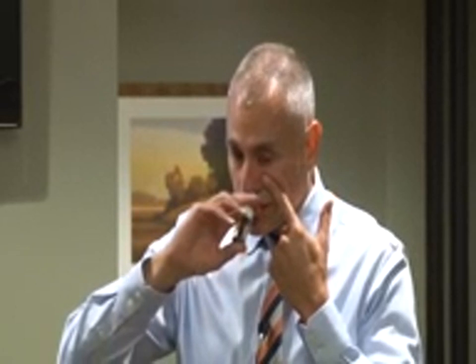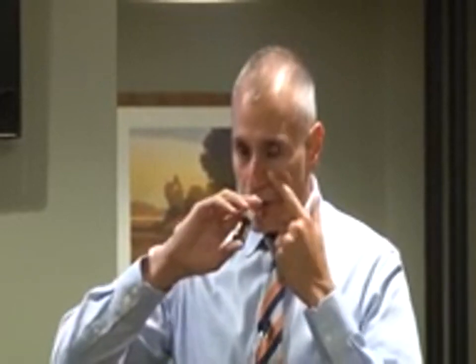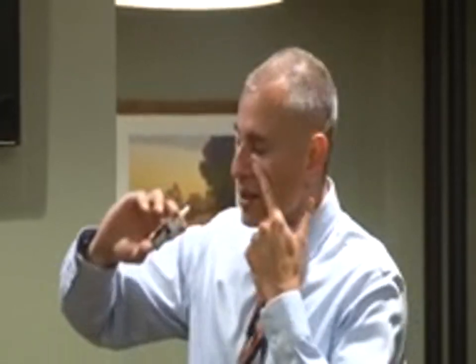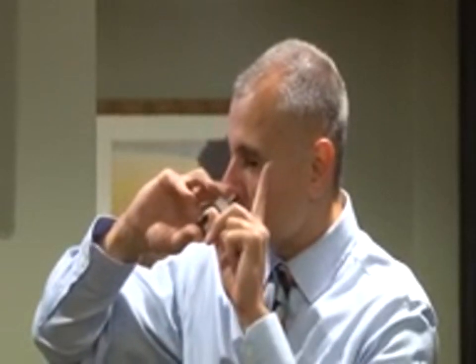So when you spray it, you don't inhale, you let the medication go in the nose, and then if you need to sniff back a little bit so it doesn't drip out the front, then you do it after you put the spray in, okay? So once again, you might need to sniff a little bit to keep the medication up in the nose. Proper angle is up and slightly out. So it's almost towards the corner of your eye where you're trying to get that angle, okay?